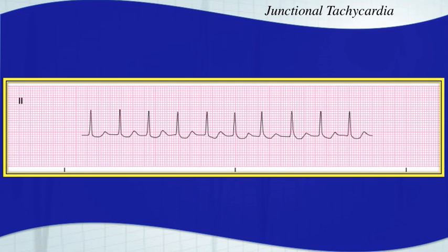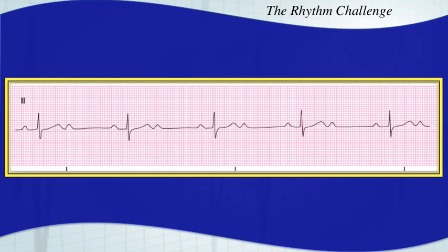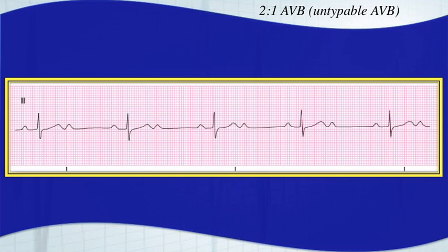This rhythm is a 2-to-1 AV block, or untypable AV block, because you can't decipher this between a Mobitz I and a Mobitz II. So we just call it a 2-to-1 AV block, or untypable.